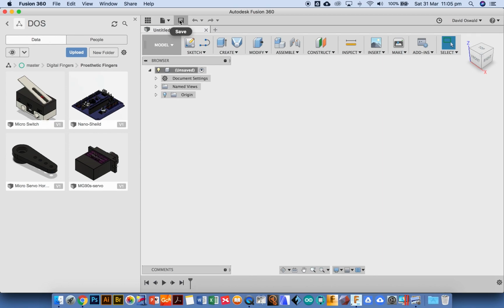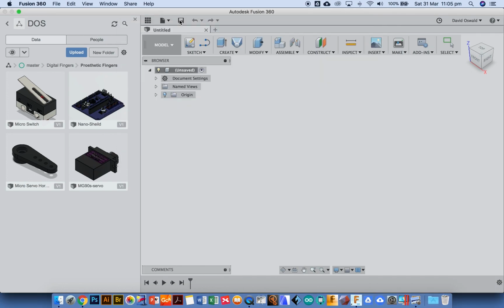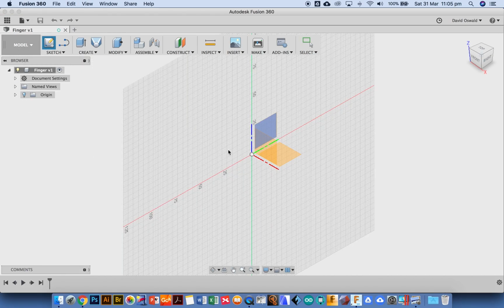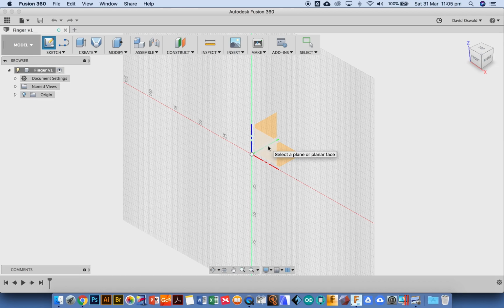The very first thing I need to do is to name it. I'm going to call it finger. Enter. I can probably hide the folder. It's going to start to save that. I can hide the folder structure. I want as much space as I can get here. And my very first job is to click on Sketch. Probably, rather than laying the finger down on the horizontal plane, the ground, I'm going to put it vertical because it's probably going to be that way more in the model later.